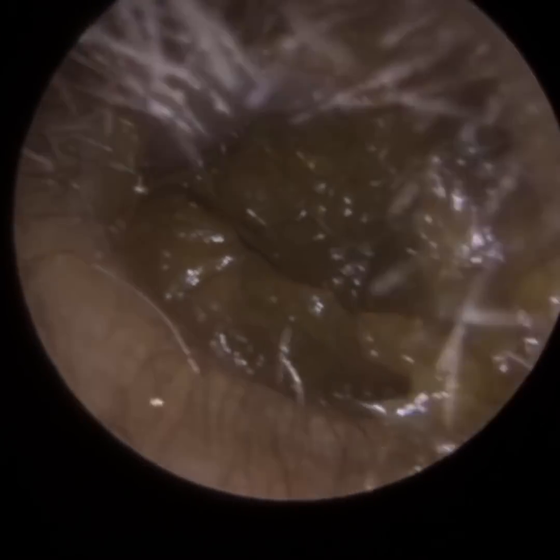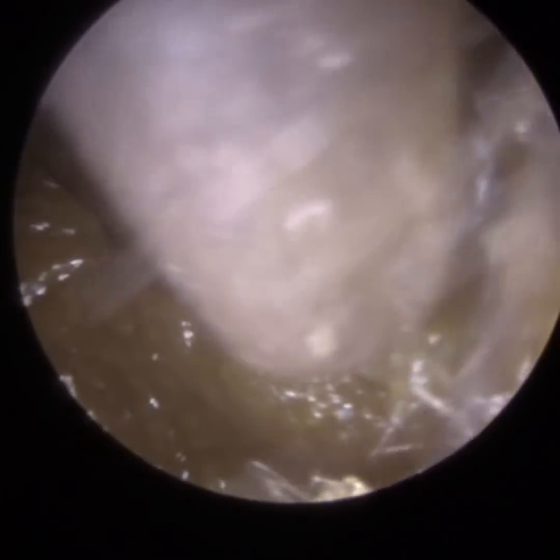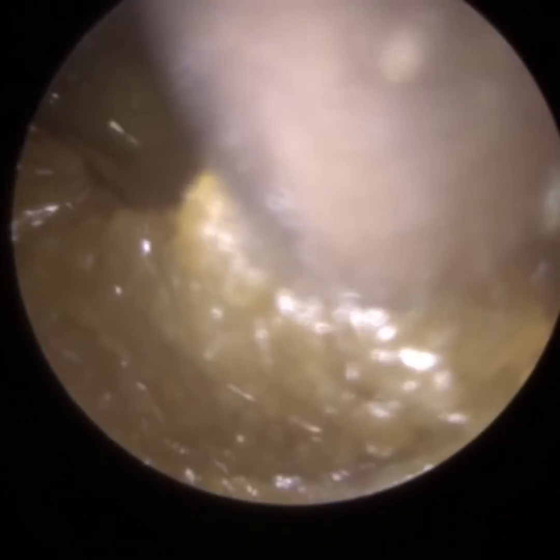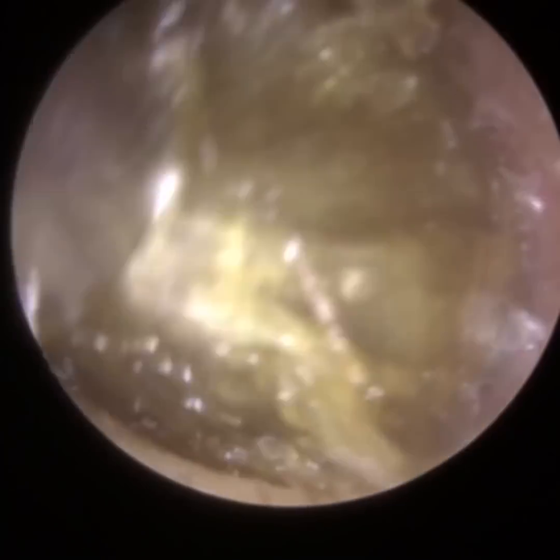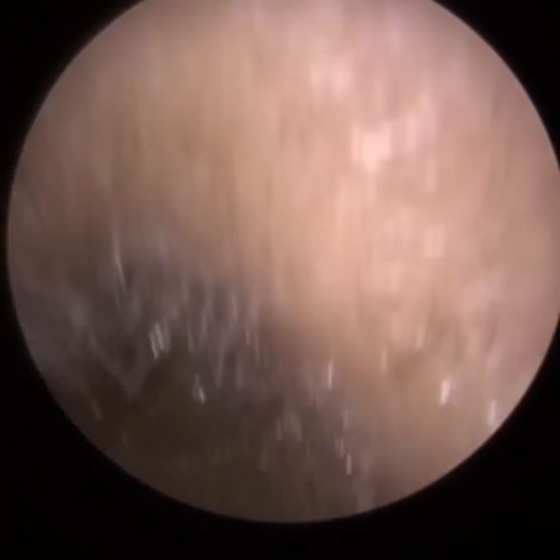This is patient 2. You can see a very similar consistency of wax, very wet, glutinous. Ironically, both patients were of African descent, and so there was a bit of a trend there. But being in the UK, from a European perspective, a lot of people from Europe also have this wet earwax gene mutation. So we do get a lot of patients here with wetter wax. If you see some of the procedures performed in the Far East, for example, they have much drier wax.